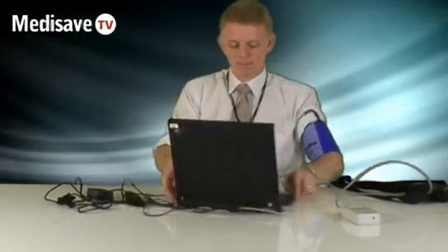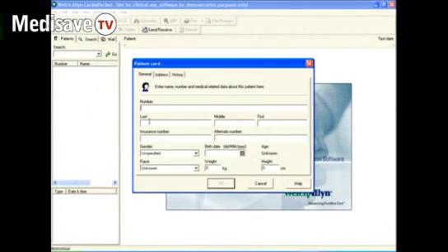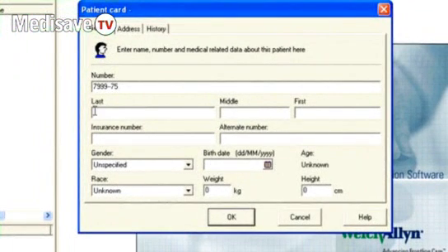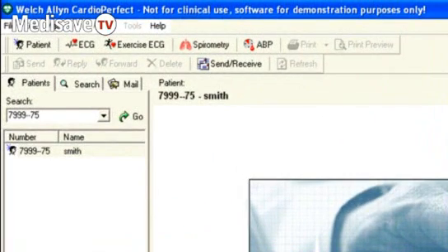All the setup for the ABPM is done on the computer. So when you're ready to take the test, you go into the Welsh Allen Cardioperfect software and enter the patient details you want, which can include the patient number and/or their surname. When you're happy with that, click OK. Those details go into the database, and then you can connect the unit to the PC with your USB cable.